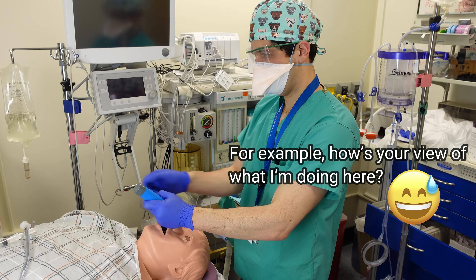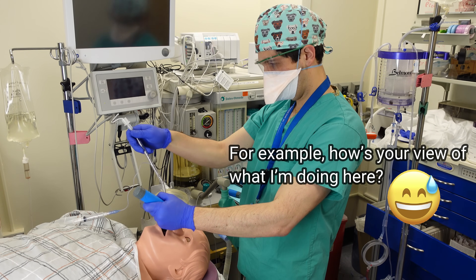An extremely important principle to keep in mind if you are a trainee learning how to intubate is to narrate everything to whoever is supervising you. Your supervising anesthesiologist most likely won't be able to directly see what you're seeing, so it's really important that you just describe everything as you move along.